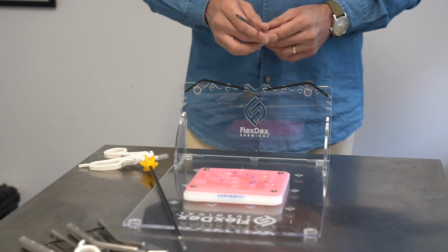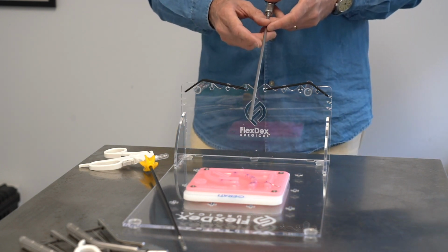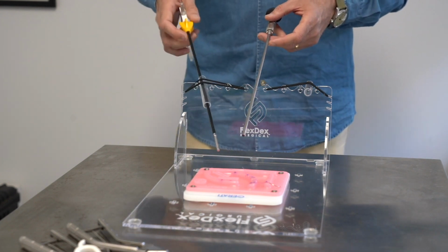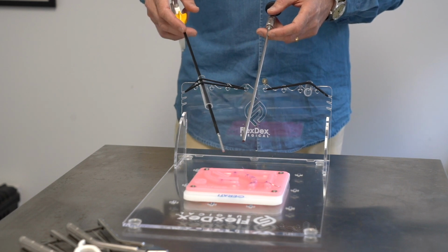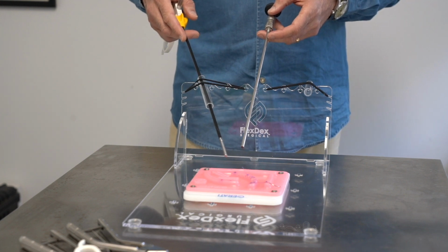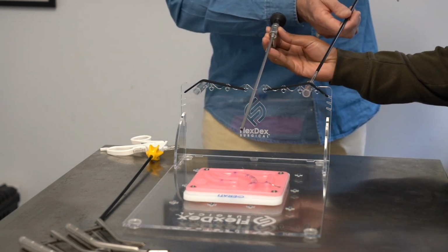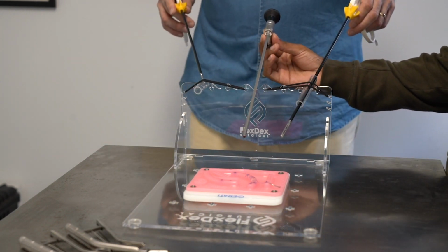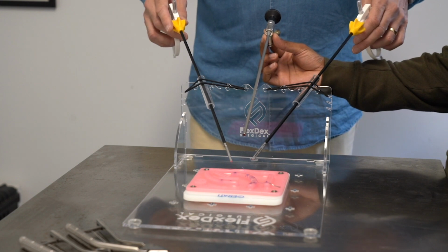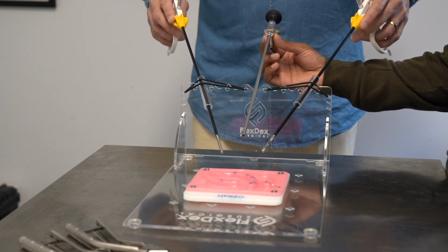Now, triangulation is a really important concept with laparoscopic surgery, and the idea with triangulation is that you have the telescope or the camera in the middle, and then you have your instruments on either side, equidistant from the telescope, so that your movements and the target is always in the center of your laparoscopic field. So here we have the laparoscopic telescope in the middle, and then we have our instruments on either side, and the target is down here. And so when the scope is pointing at the target and the instruments are on either side, it gives you the correct orientation so that your movements are intuitive.